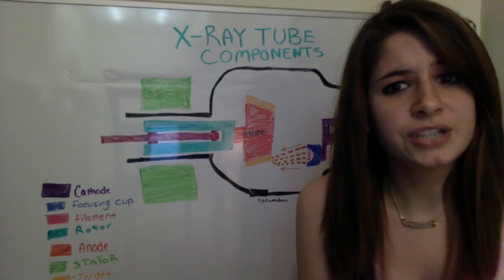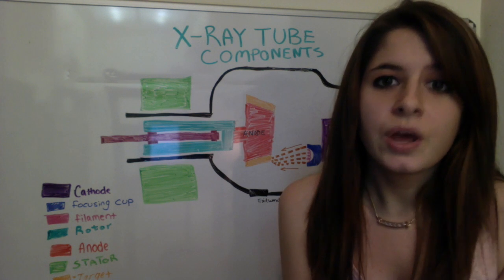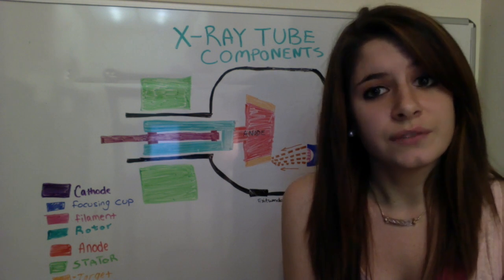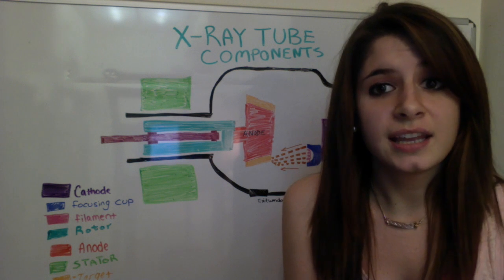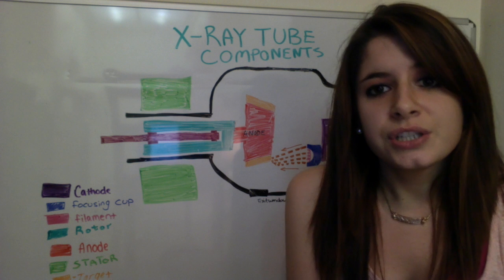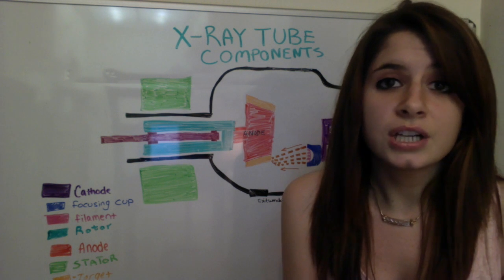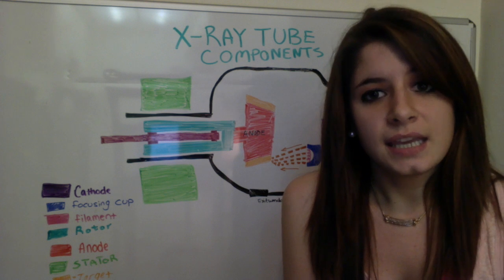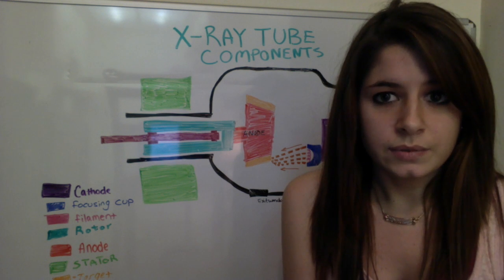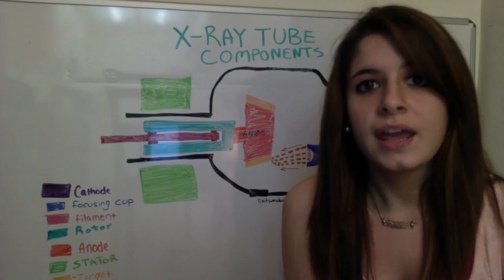The function of an X-ray tube is energy conversion. The tube acts as a vacuum tube where electrical energy is converted into X radiation and heat. The heat is an undesirable byproduct. X-ray tubes are designed and constructed to maximize X-ray production and to dissipate heat as rapidly as possible. The basic internal components consist of an anode and a cathode.